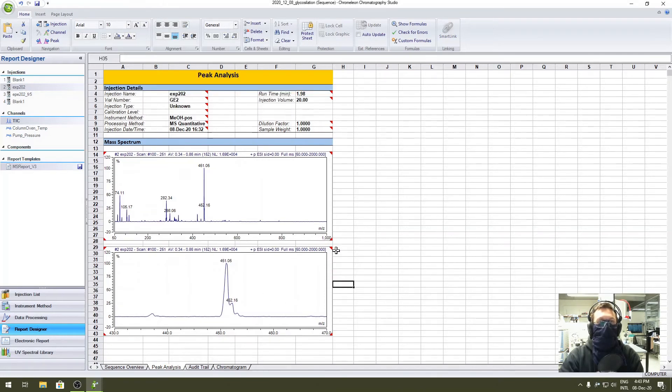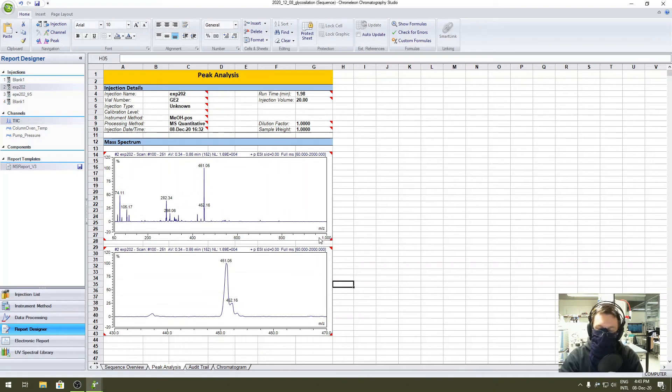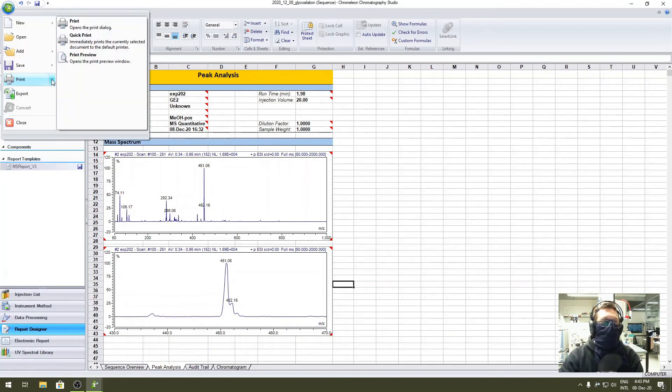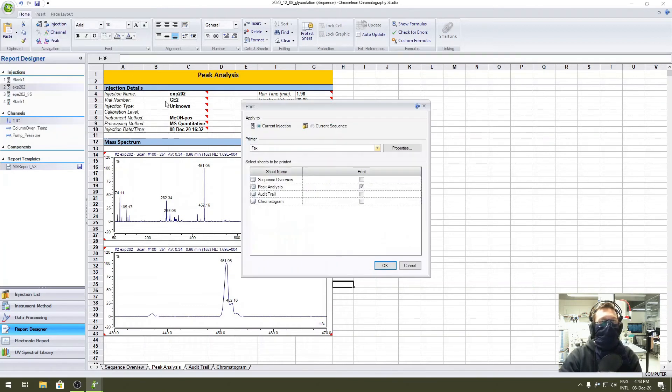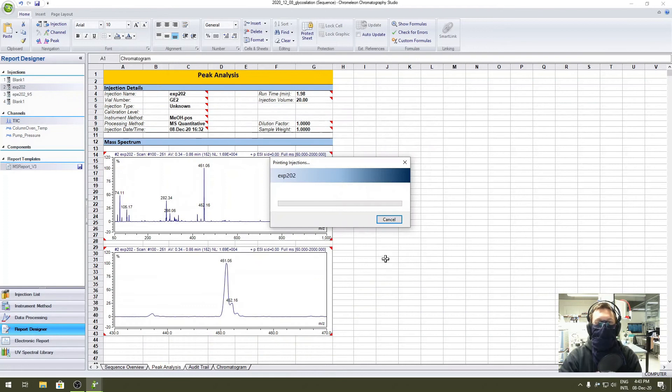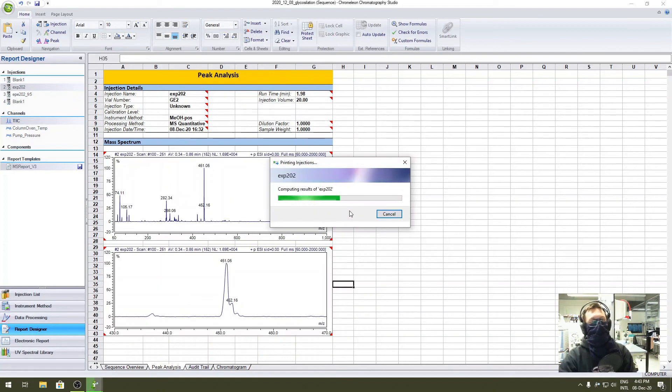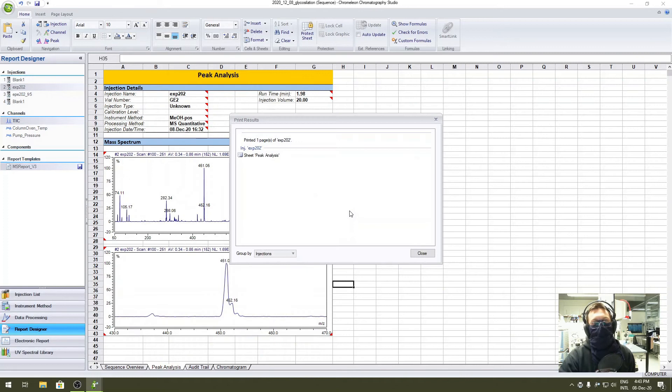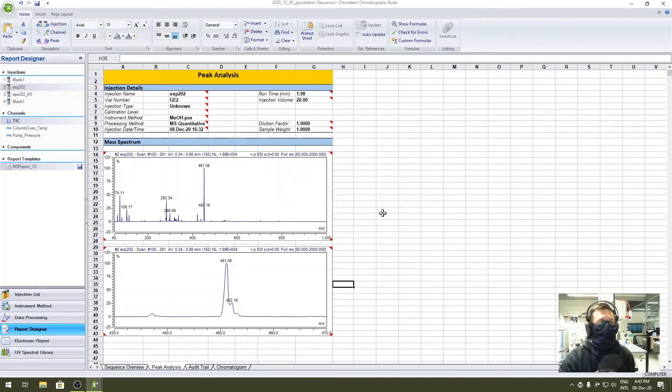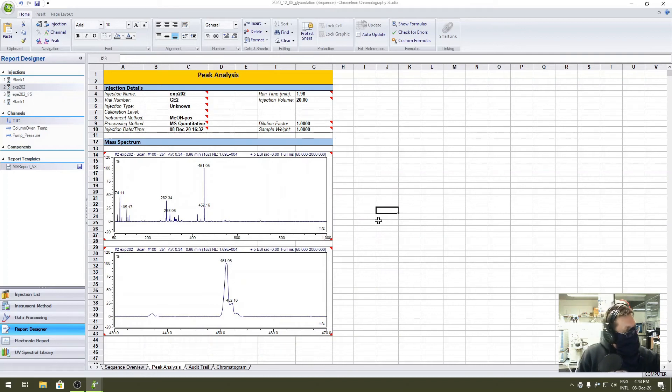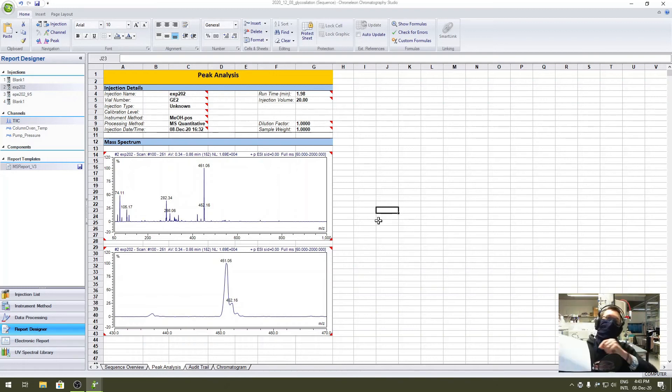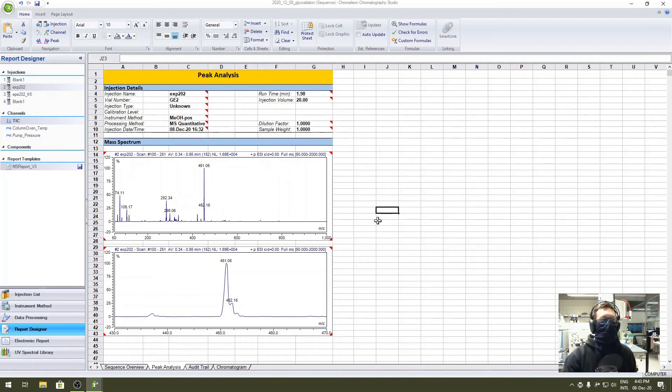So now probably you want to print it. There will be an upload in PDF. Once it's ready, I'll get you through how to make that one. For now, we want to print it, so go for Printer, Print. We want to pick only the peak analysis and print it in the current injection. Click OK, wait for a few seconds. Either click yes or no, it doesn't matter. And now you see the printout. That's it, you are done.